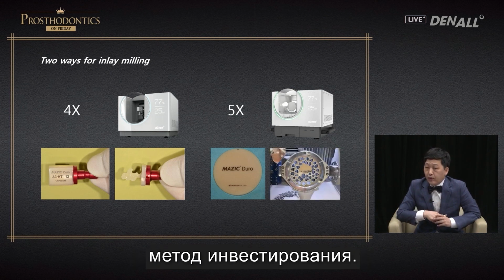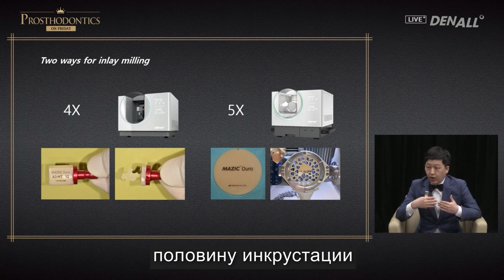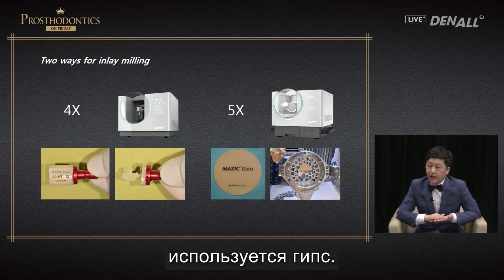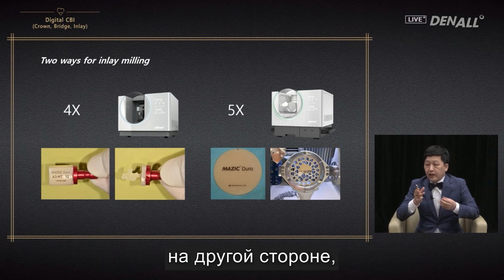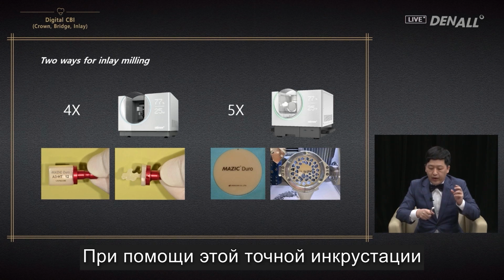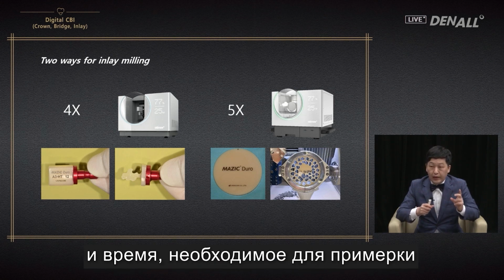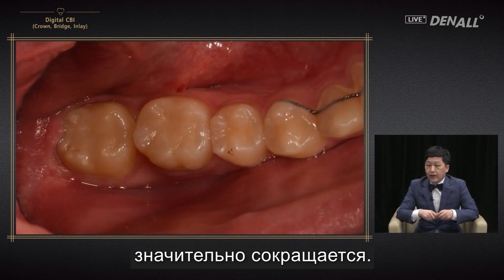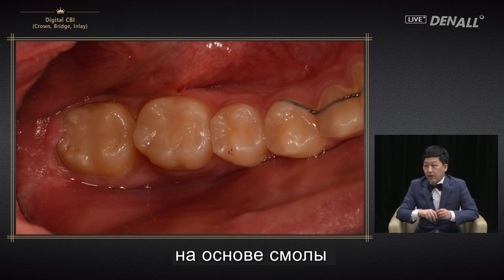Recently, the investment method has been introduced. You process half of the inlay first, and then plaster is used for investment. Once the plaster becomes solid, if you do investment on the other side, you can do inlay milling without a connector. By doing this, accurate inlay processing can be done, and the time required for trying in within the oral cavity is reduced significantly. Finally, resin adhesive is used to set the inlay. And that's it.